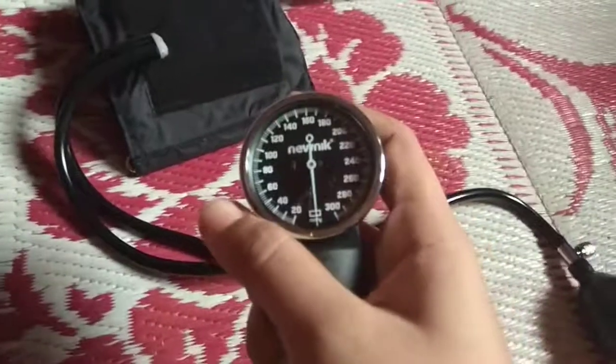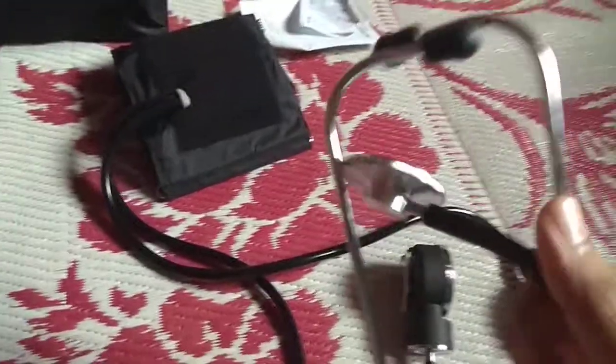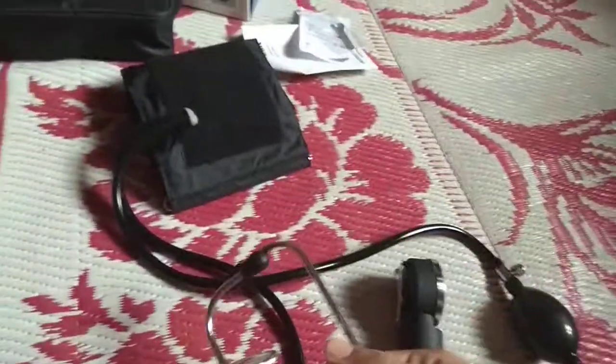I have used this for 3 days and it works really good. For just 700 rupees, you get even this stethoscope, which is really good quality and it's even loud too.